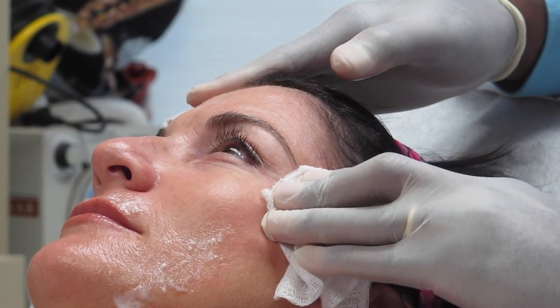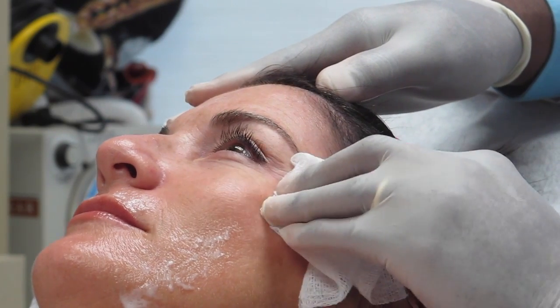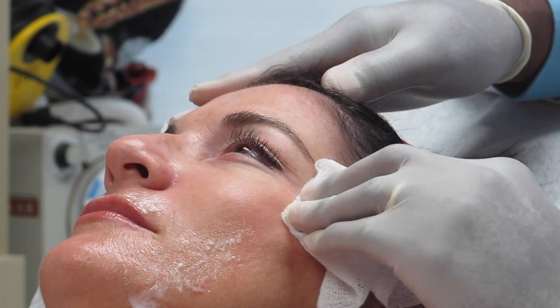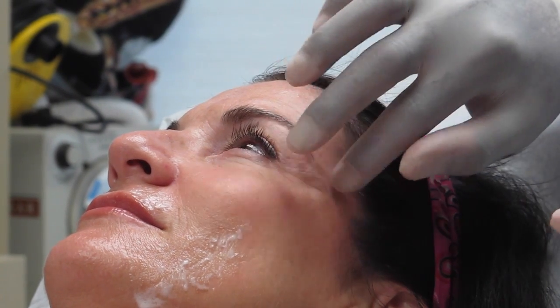Right afterwards, I'm going to massage a little bit. It's not that somebody should do this at home. The thing I would have you do for the next hour after the procedure is just squint about every 5 to 10 minutes, because as you squint, that forces your body to take the Botox better. Put a little hyaluronic acid on.